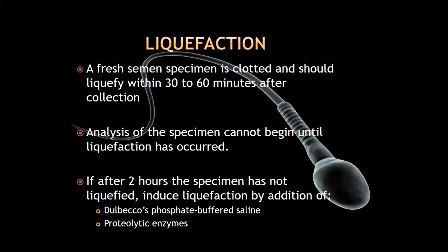Remember, the specimen that you have collected is initially a coagulum or clotted, and the enzymes secreted by your prostate gland are responsible for liquefying this clotted seminal fluid, the semen. So it would normally take 30 to 60 minutes for it to completely liquefy.